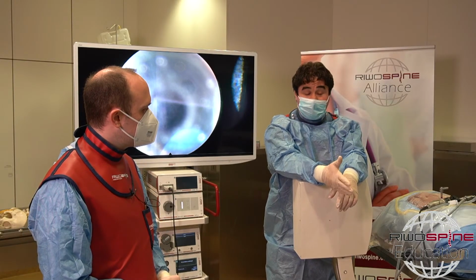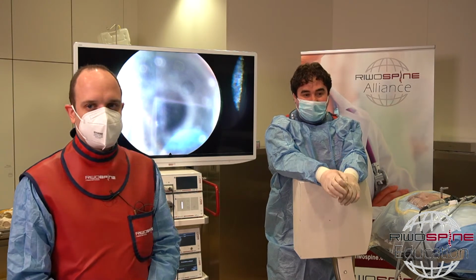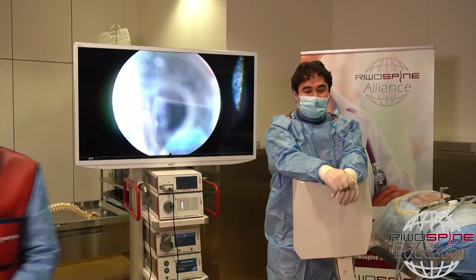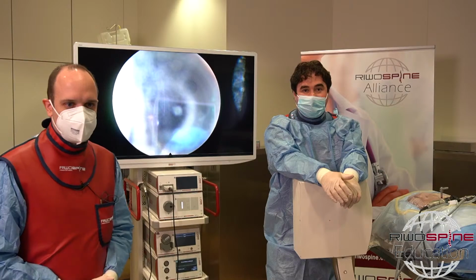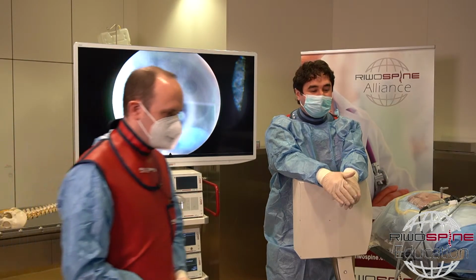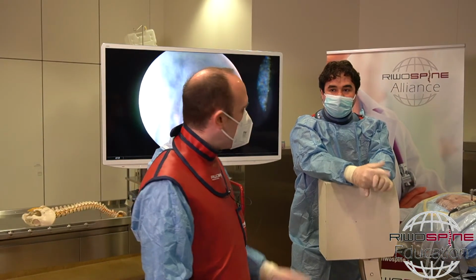First of all, you can use your bipolar, but at that time you have to place the tip of the bipolar exactly on the bleeding part of the bone. Usually they are very small. And the second possibility is the diamond burr, with which you can drill the bleeding part and stop it. These are the options.